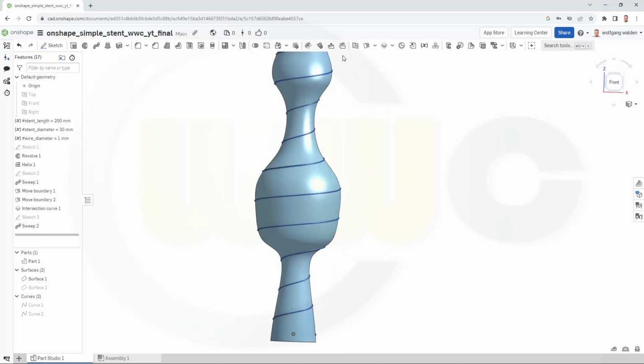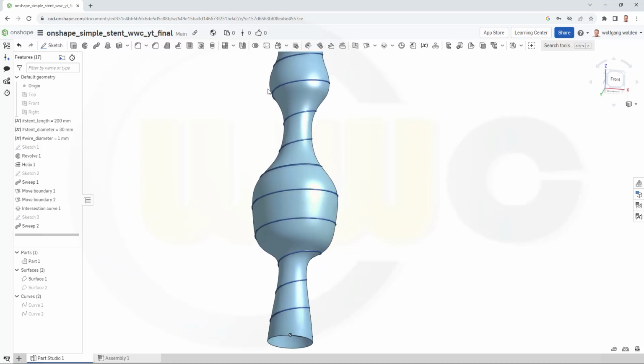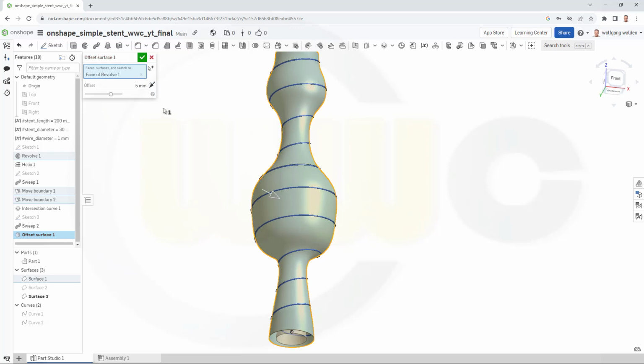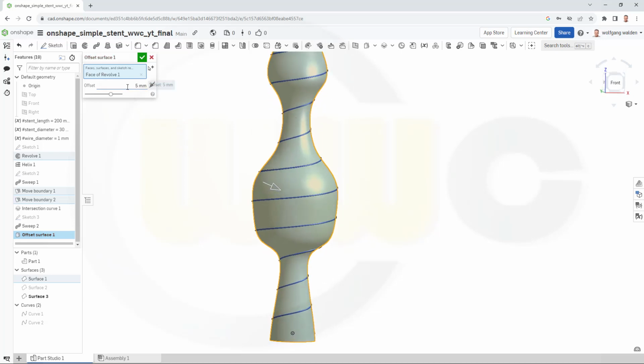So where's the offset surface? No. Over here, nope. There you go, offset surface. And I want to offset this surface. That would be to the inside, and that value should be the wire diameter. Don't forget that hashtag here, divided by 4, and confirm. That's this one.